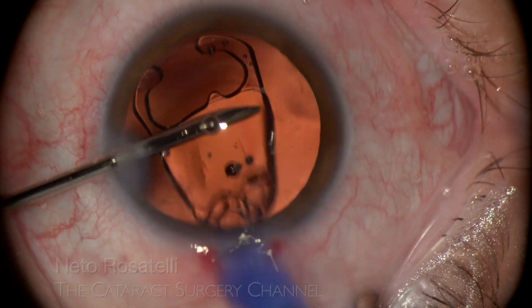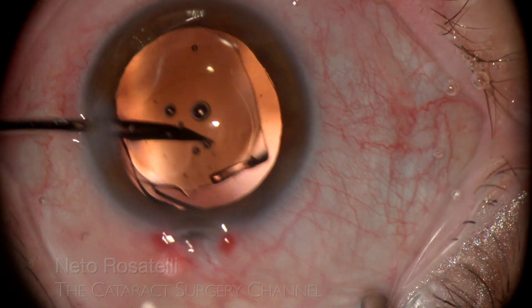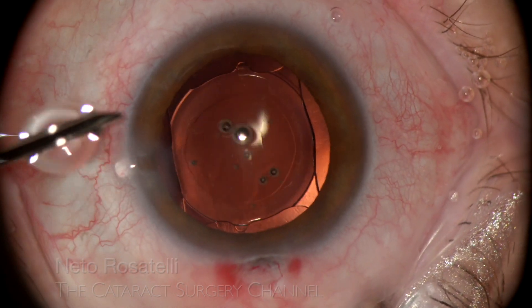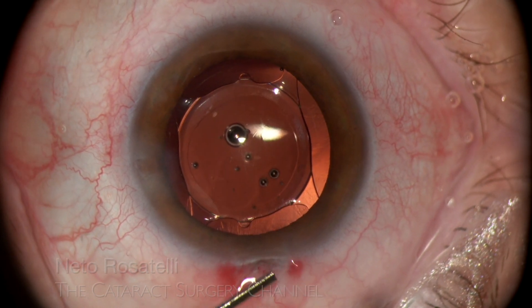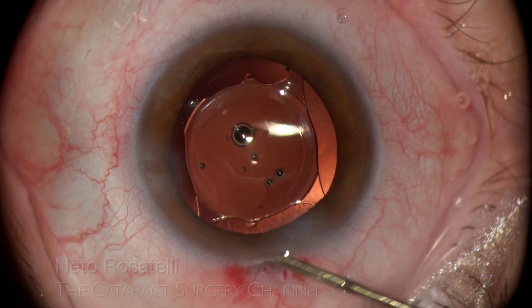IOL hydro-implantation follows, and we can see the value of an engraved capsulorhexis forceps here — what a nice capsule overlap. If we were to gauge the rhexis diameter by the size of the cornea, we might end up with a too-large rhexis. Myopic eyes can fool us easily on that.